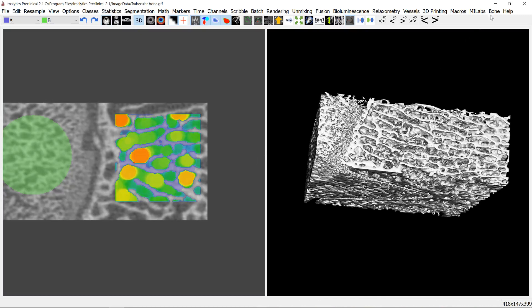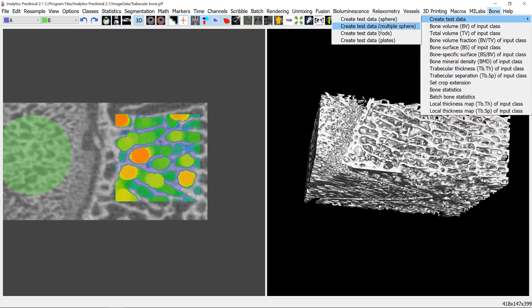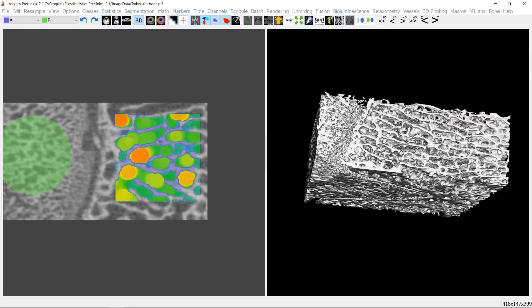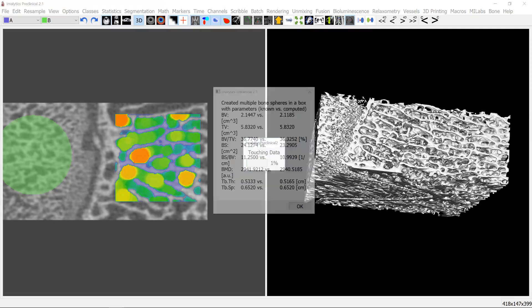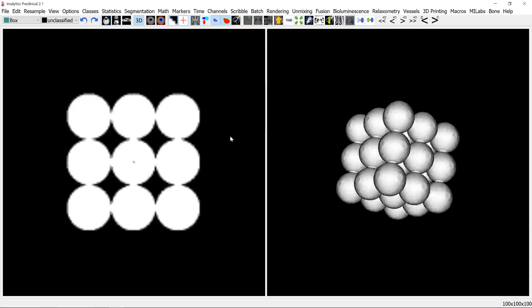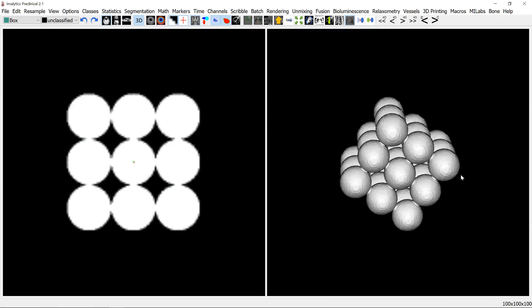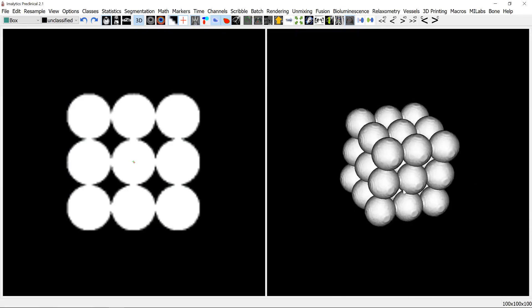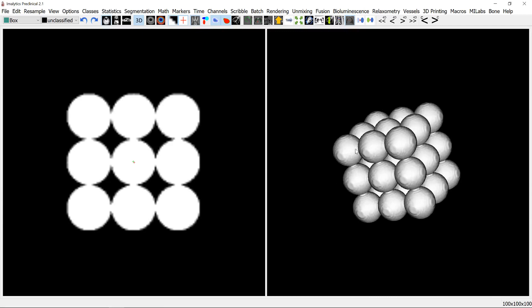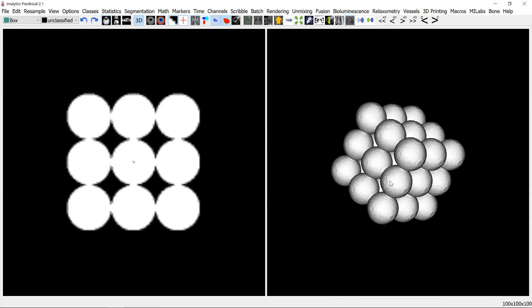You can also here create some test data sets like a sphere or here are multiple spheres. And that because for these examples the solutions can be computed analytically and it's a nice example to test if the software is working correctly. So you can see the parameters they are similar between the known and the computed versions. And so what this example is, is just an array of a lot of spheres and we know the surface of these spheres for example and their thickness.